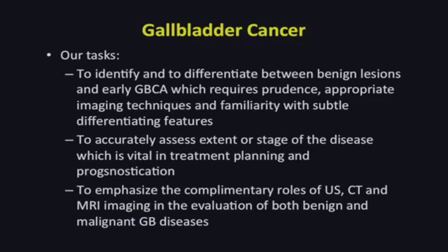Our task also includes accurately assessing the extent or stage of the disease, which is vital in treatment planning and prognostication. And as we have seen, our task is to emphasize the complementary roles of ultrasound, CT, and MRI imaging for better evaluation of both benign and malignant gallbladder diseases.